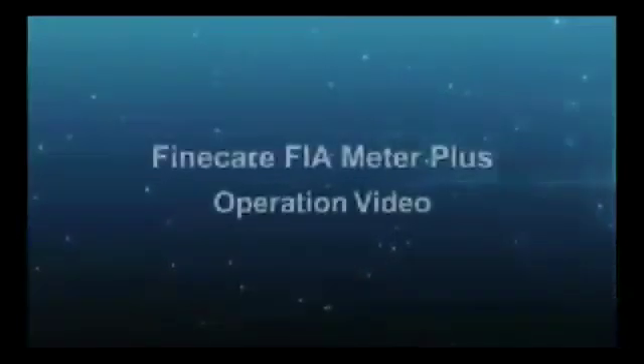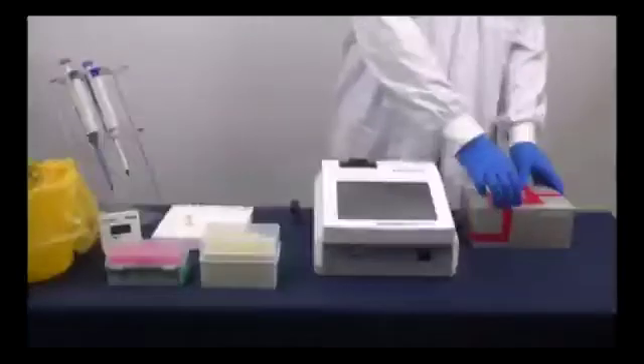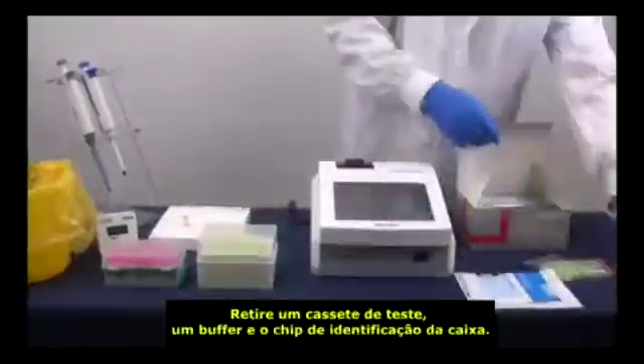Welcome to Wonderful's FineCare FIA Meter Plus operation video. Take out a test cartridge, a buffer, and the ID chip from the box.